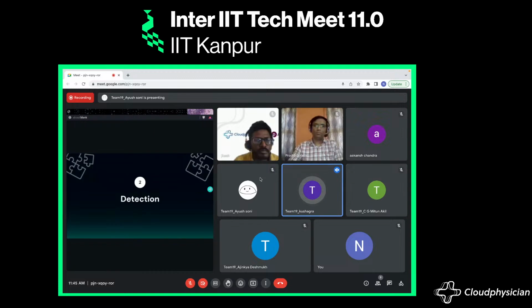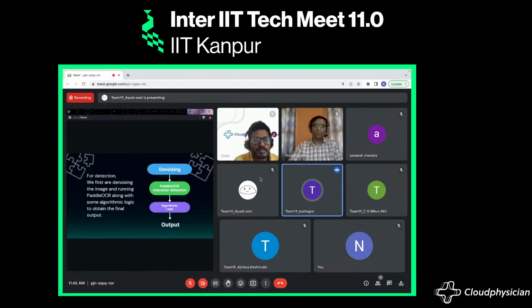Now I will start with the detection part. We had broadly two possible approaches to the detection part. First, to train our own model to detect the text from the display. Secondly, to use a pre-trained model or an OCR to detect the text in the LCD display. Since we did not have a large dataset, we decided to use an OCR.